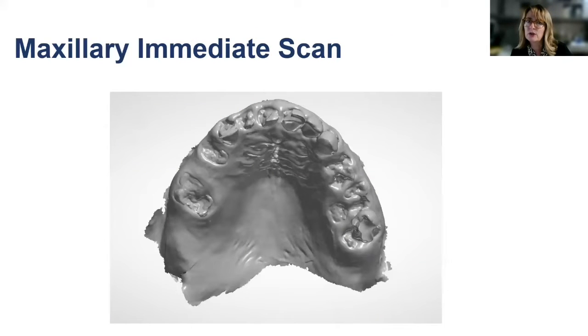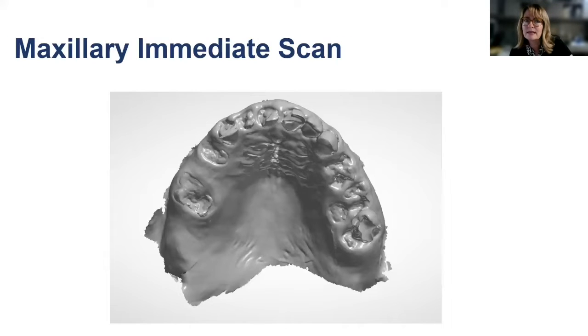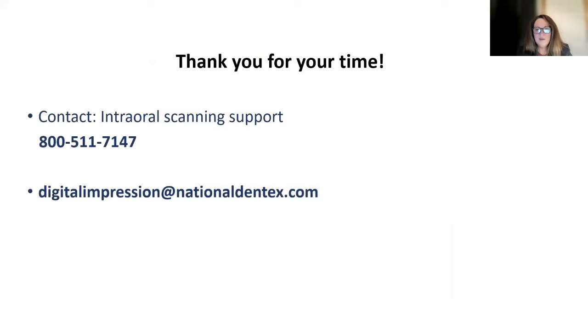I just wanted to show you a few scans of partially and fully edentulous patients in 3Shape. So this is very doable. This is the type of scan that we get on a routine basis. And this, of course, is going to be for an immediate denture. But notice how well they were able to acquire all the data. I mean, really, really nicely done. And we have another one, Kelly.